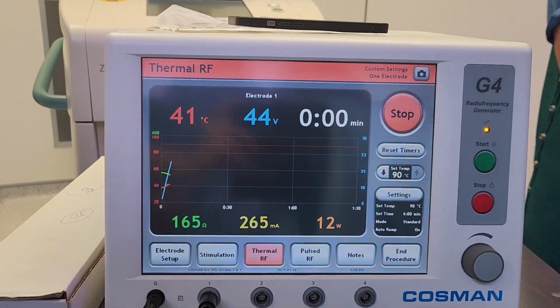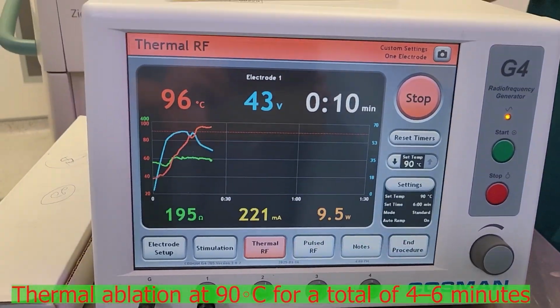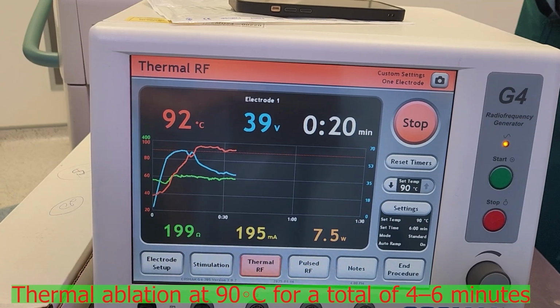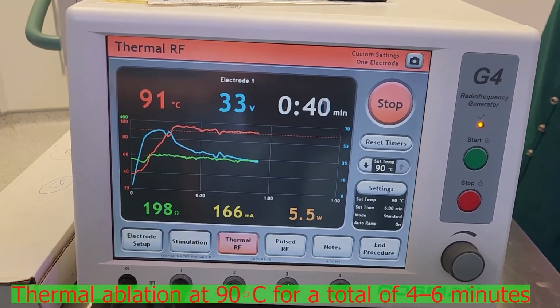Then we apply our thermal ablation, and this is usually at 90 degrees centigrade for a total of 4 to 6 minutes. Here the video has been speeded up significantly for the sake of time.